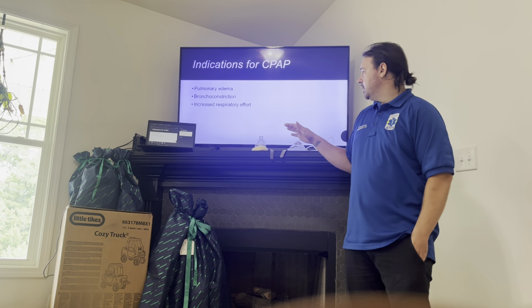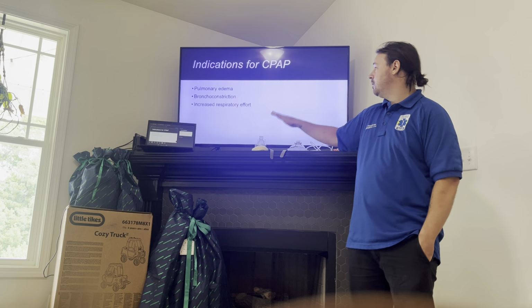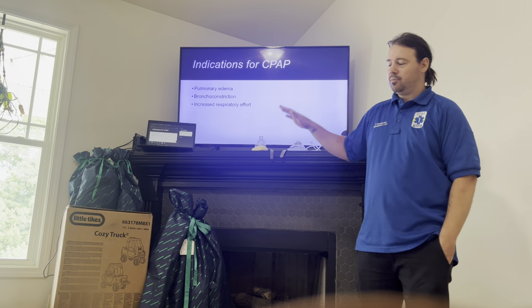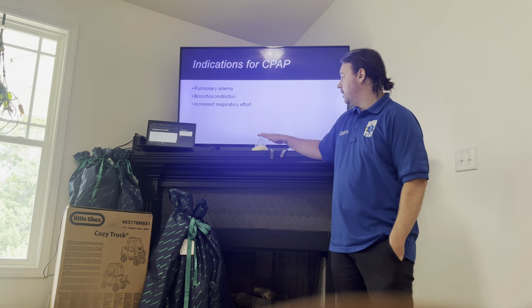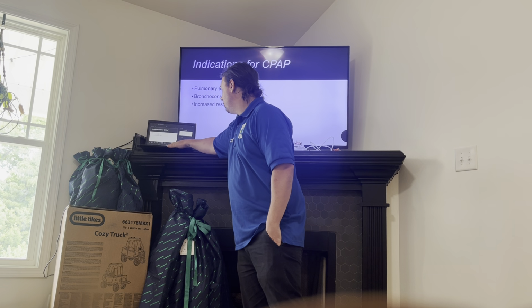We'll talk about the contraindications next, but if you see a patient in respiratory distress, even if you're not sure if it's pulmonary edema or bronchoconstriction, bronchospasm, you are more than likely going to end up placing them on CPAP regardless of it, so go ahead and get it done quicker.